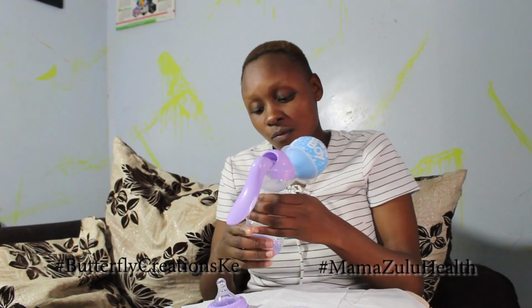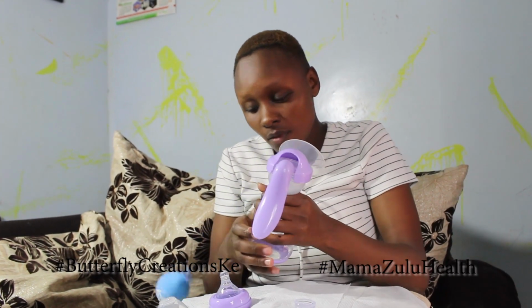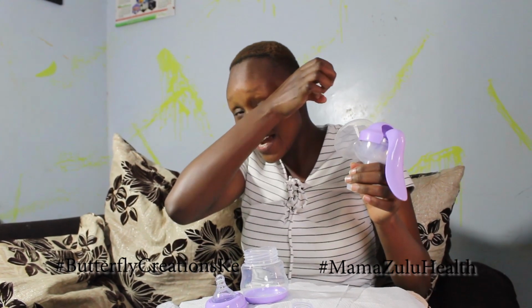Once it's filled and you still have a lot, maybe you have pumped only one breast, you just transfer this to your other. You have to have 2 or 3 feeding bottles, by the way. So you have to have 3 clean feeding bottles. You can carry 2 at work, and then you have the others at home.